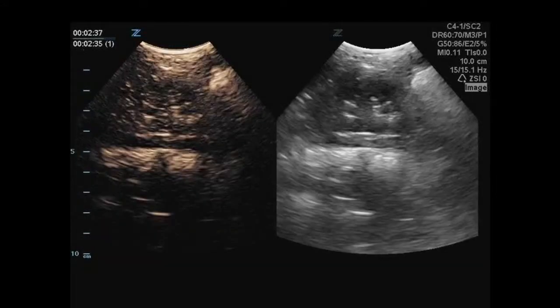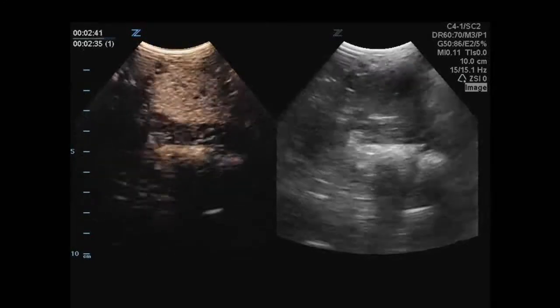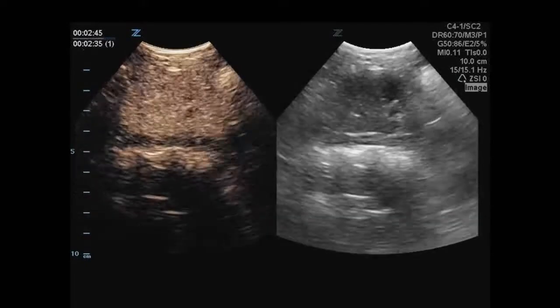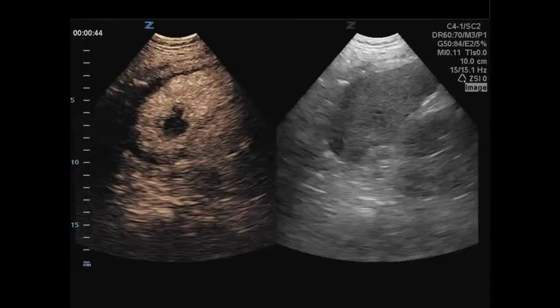Right? And if it's missed time, like the contrast cleared, your CT is not going to be helpful. My contrast cleared, I just inject a little bit more, right? That's the benefit of dynamic imaging. You can adjust what you're doing based on what's going on and what the images you see. CT, unfortunately, is a very static image.